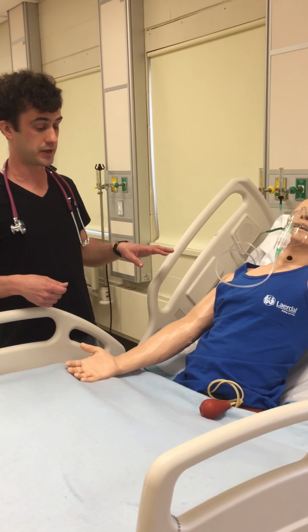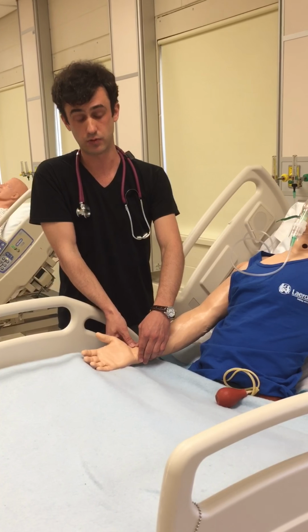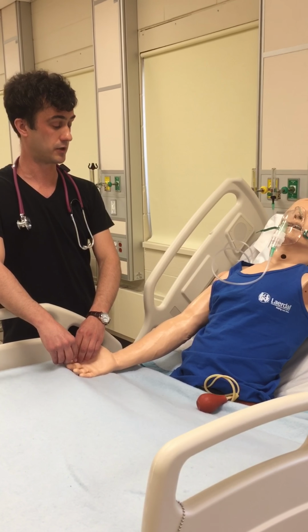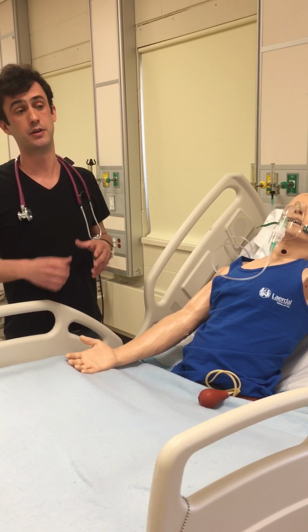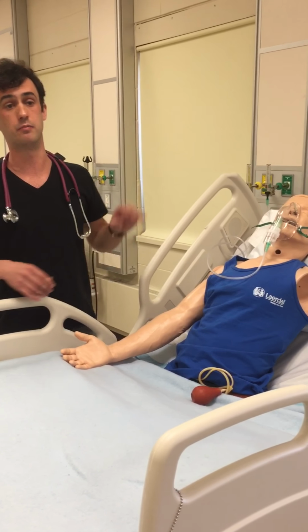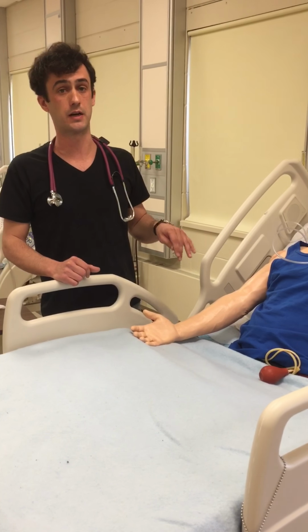About halfway through the breathing treatment, I would reassess the patient's vital signs, again checking the pulse rate, the respiratory rate, and the oxygen saturation by using a pulse oximeter. I would monitor the patient for any adverse reactions, the main one being a 20% increase in heart rate. If a 20% increase in heart rate occurs, I would immediately stop the breathing treatment and notify a nurse or a doctor.